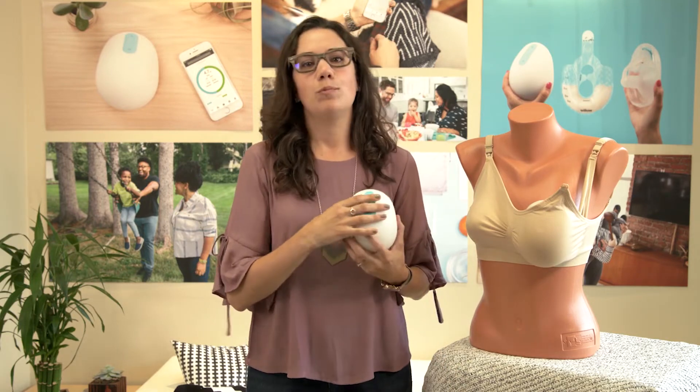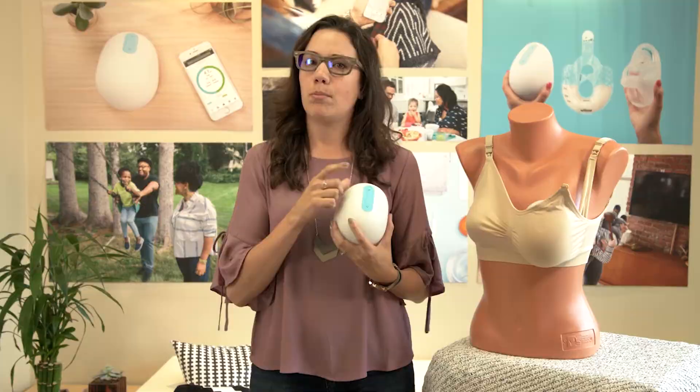And lastly, before you remove Willow from your body, pause the pump and then break the latch. And don't forget, we are here to help. Give us a call.